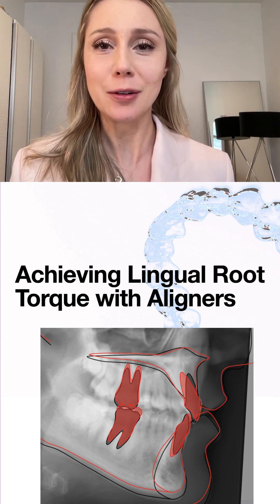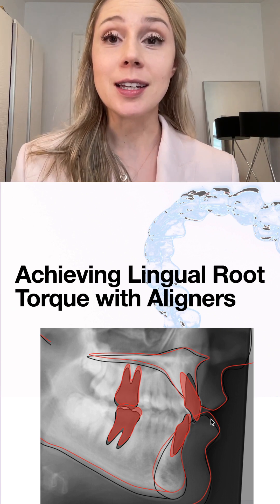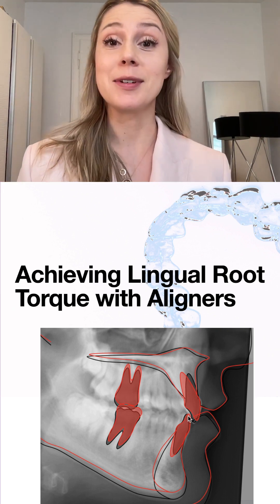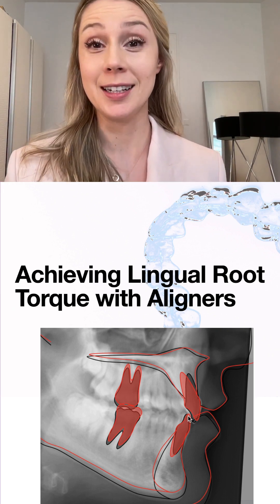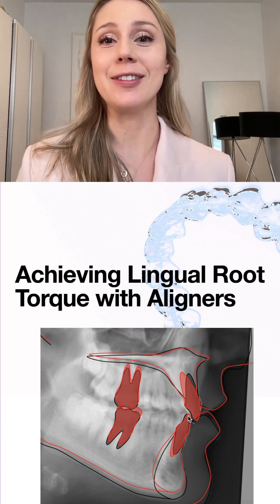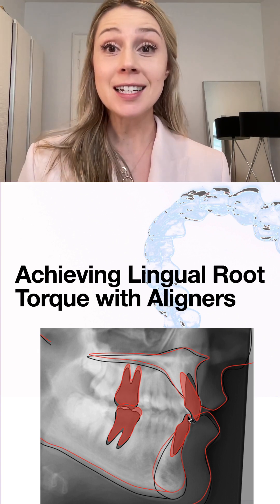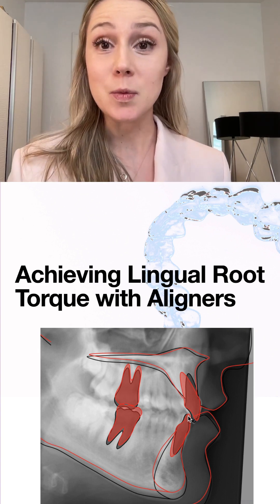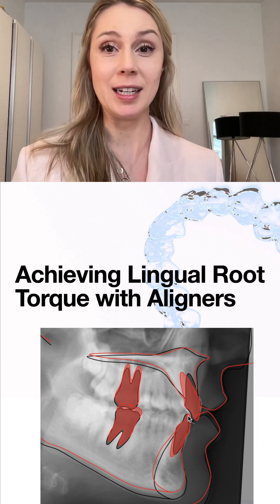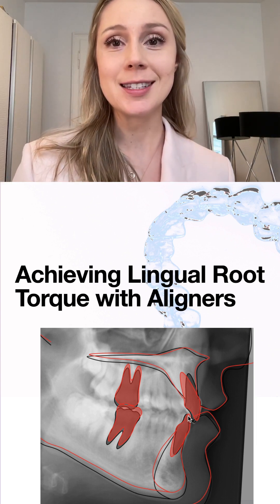How to achieve lingual root torque using aligners. Here in this picture you can see incisor torque that was actually achieved with aligners — in total, 20 degrees of lingual root torque. For a long time I didn't believe that was possible because I failed so many times, back when I used different aligner brands.